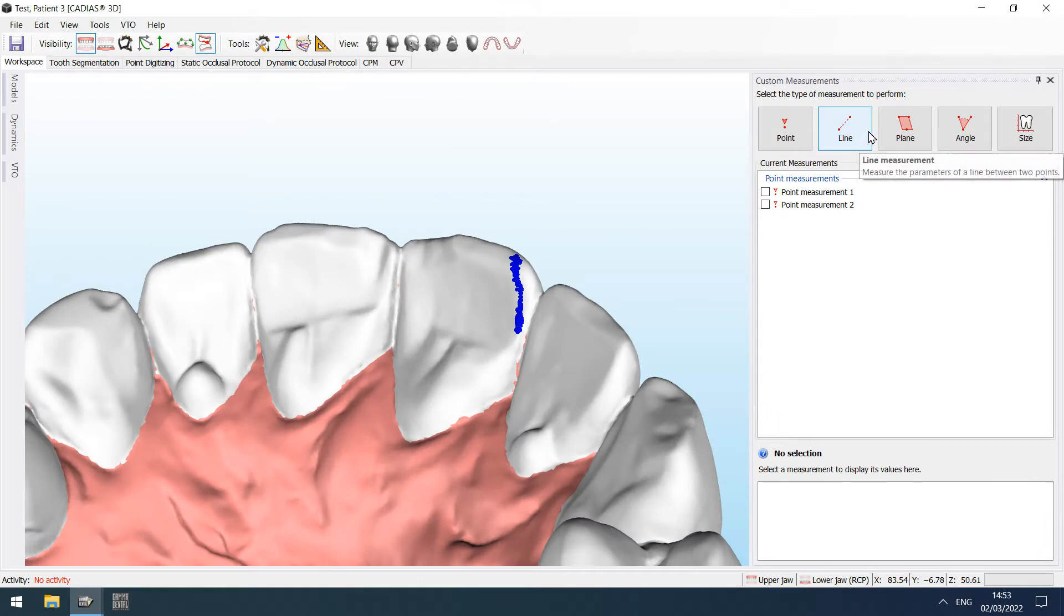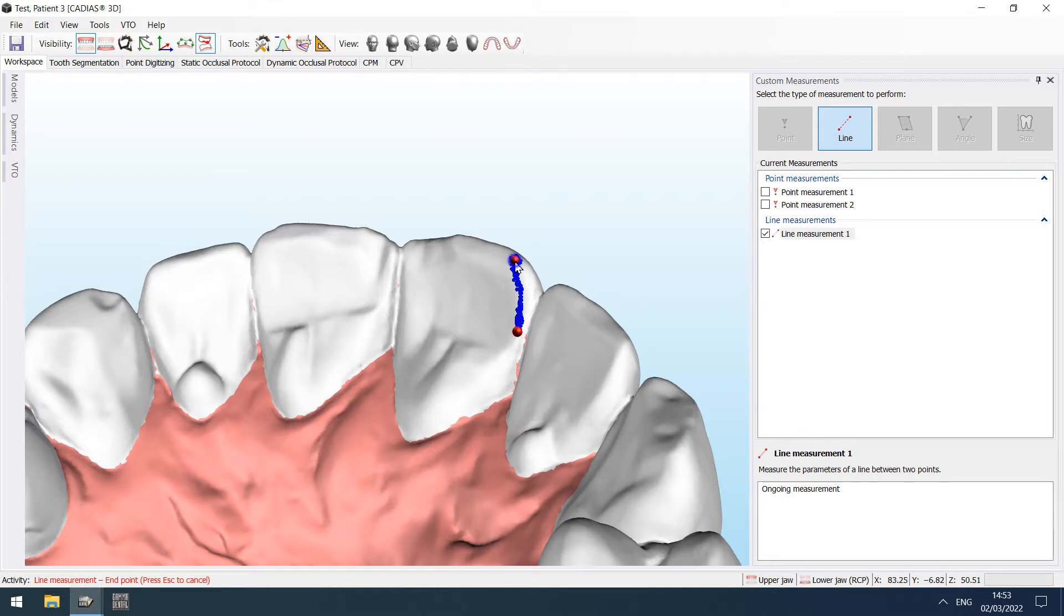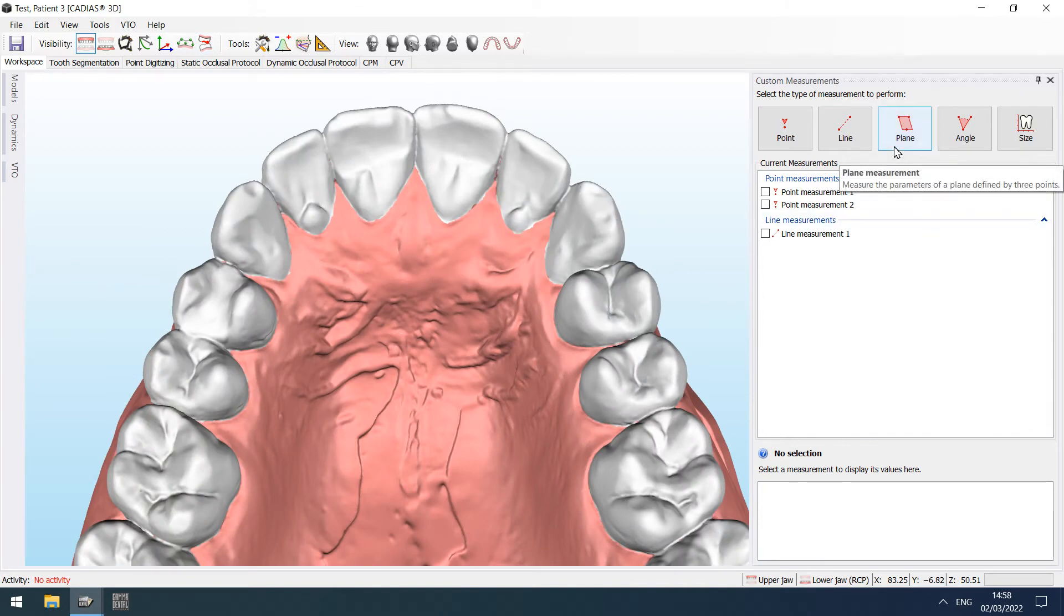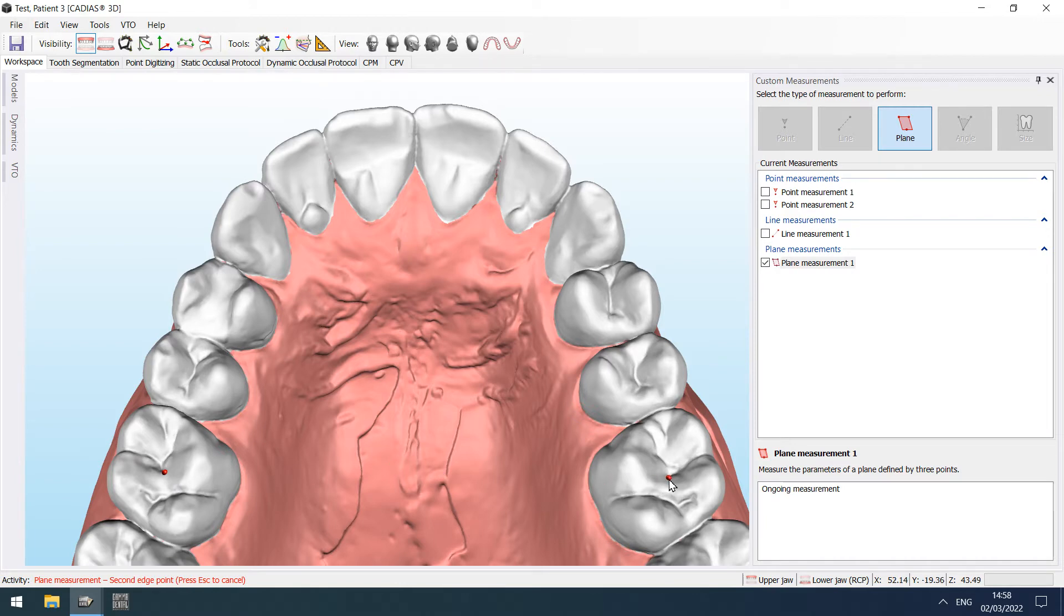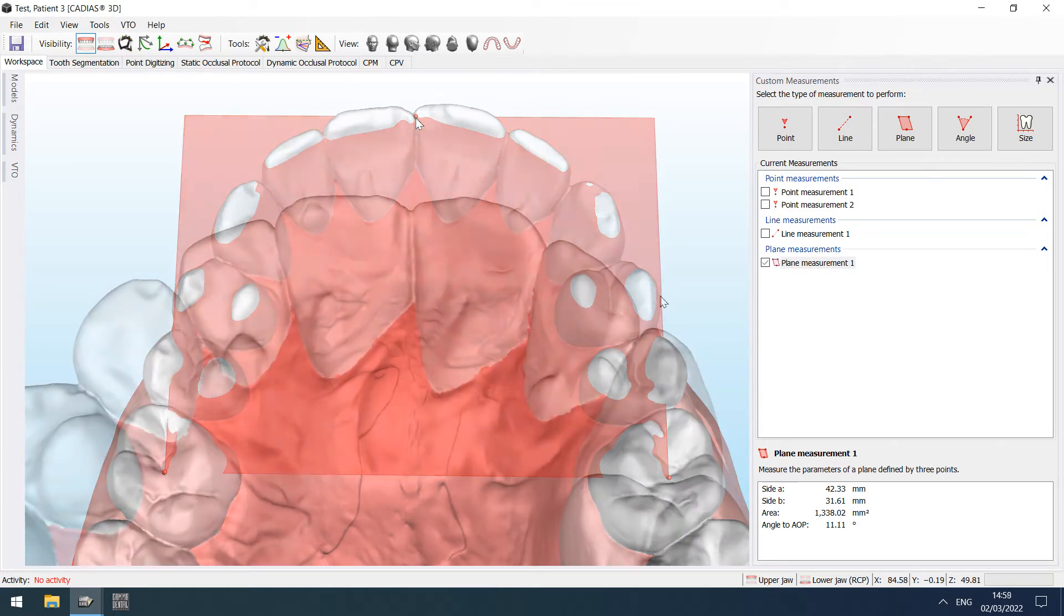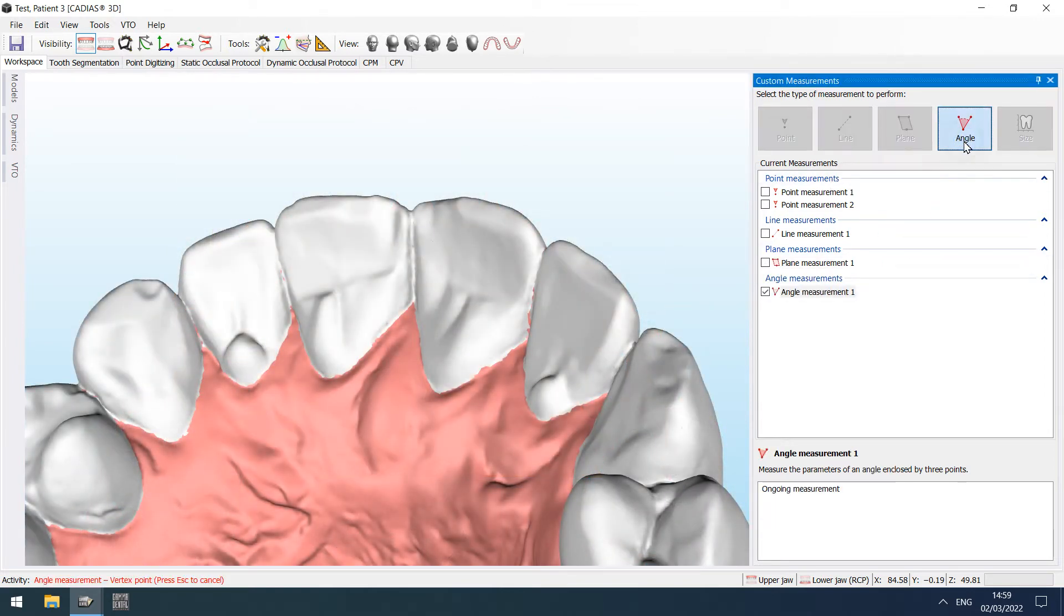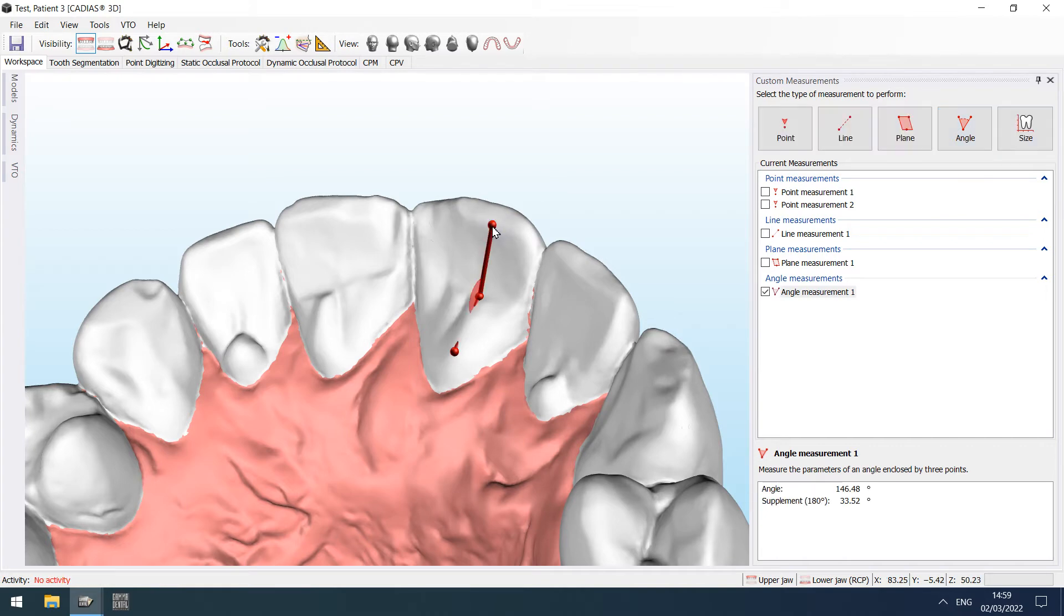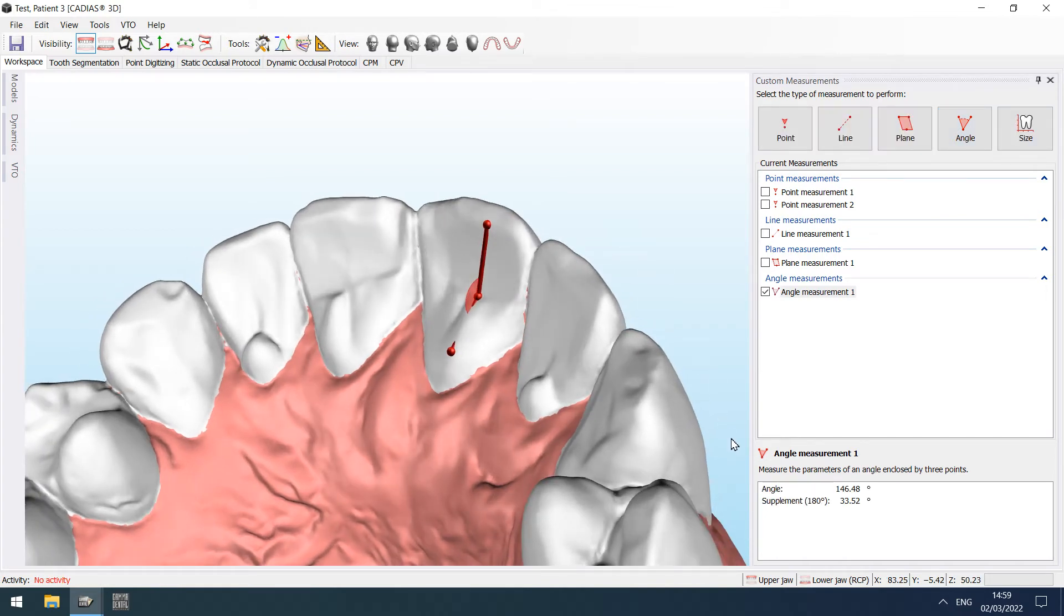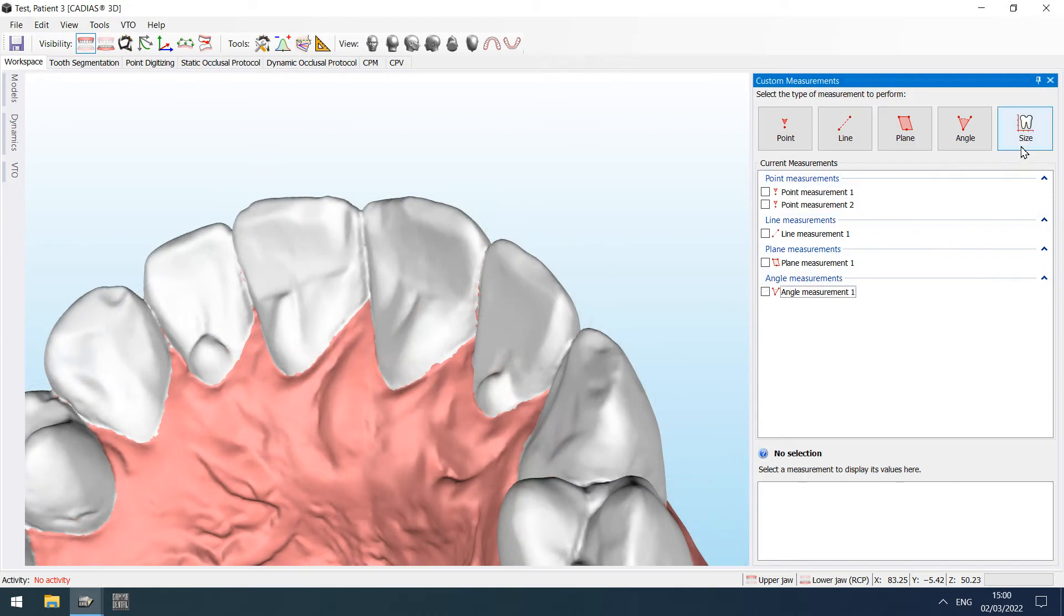It is possible to perform line measurements. It is also possible to perform plane measurements. You can also do angle measurements.